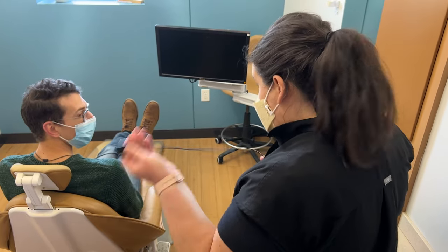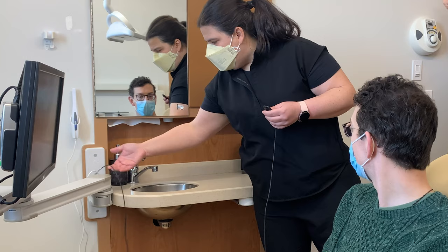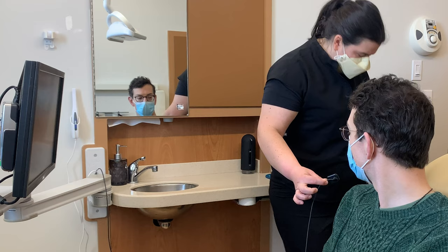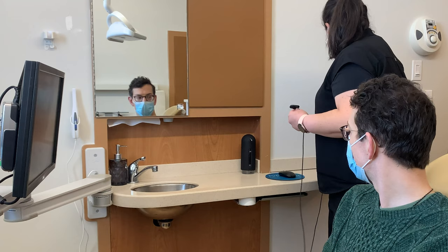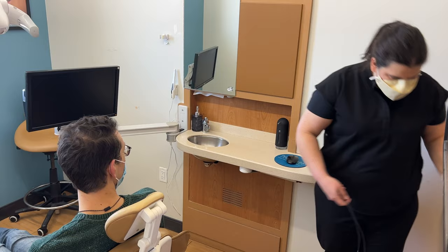When taking films in rooms, we're often asked about where to plug things in. In developing this unit, we found that placing a USB cable here and allowing that sensor to go into a mouth prevented us from having to skip over a sensor. In many offices, cords plug behind the operator, so I have to hop over it — and these things are expensive, so doctors will really appreciate that feature.